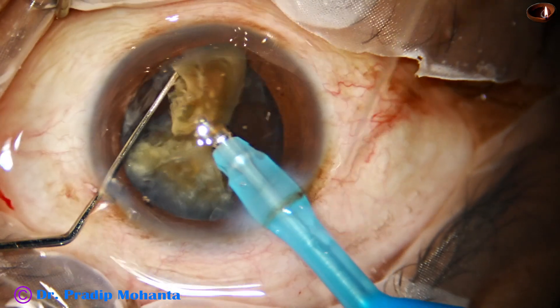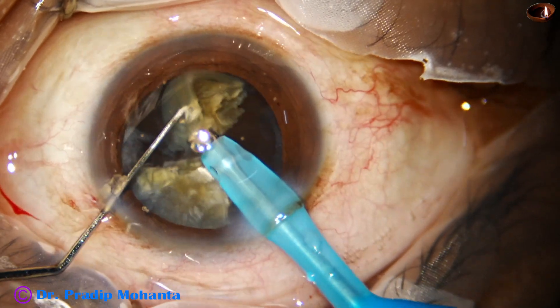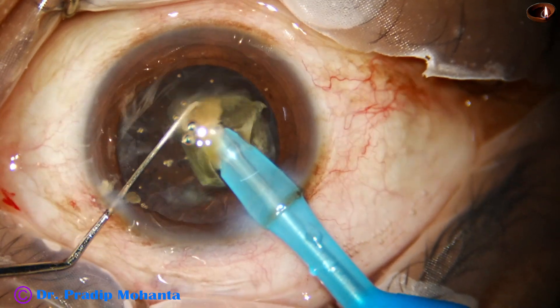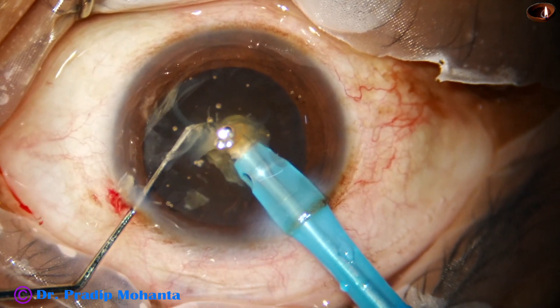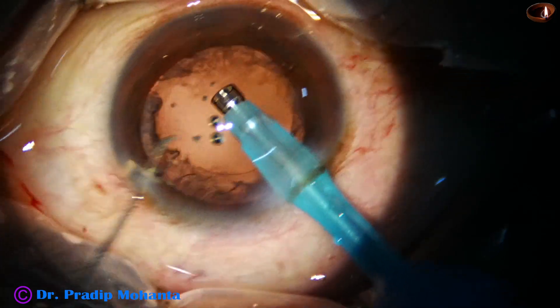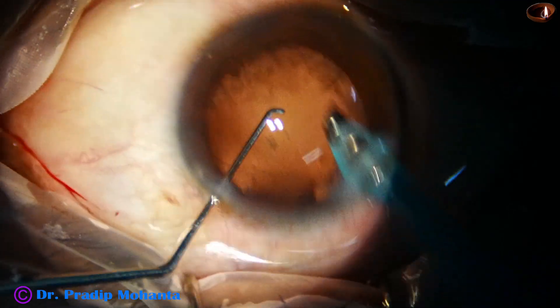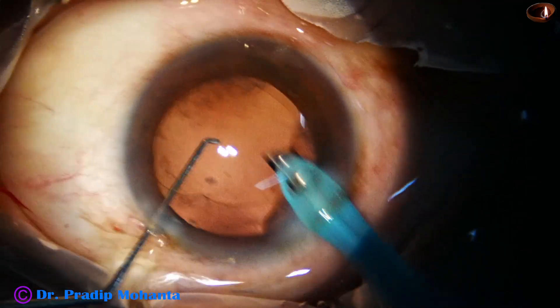The other hemi-nucleus is being divided into two, but there is some band joining the two fragments. Emulsifying one of them, then the last nuclear fragment is emulsified. The posterior capsule is far behind and there is no fear of catching the PC in this case. Whenever there is fluctuation of the position of the posterior capsule, as in weak zonules, we must be extremely careful during emulsification of the last piece. In those cases, we should use the IOL scaffold technique.